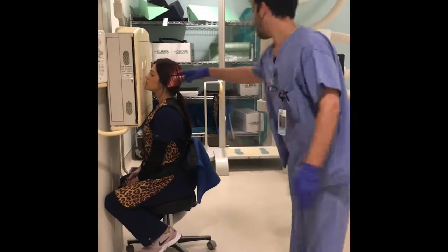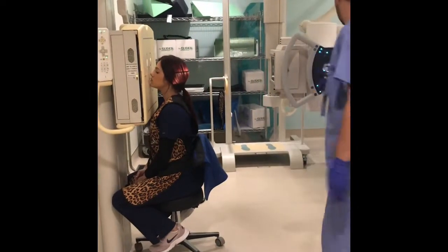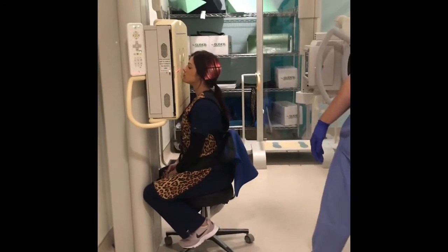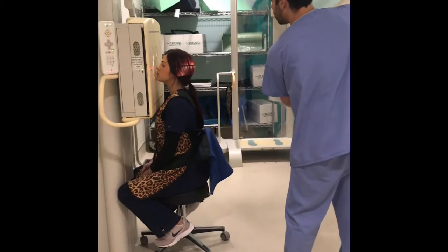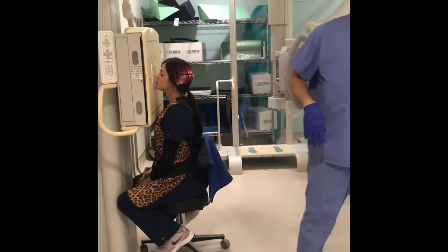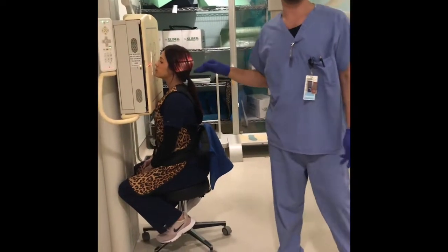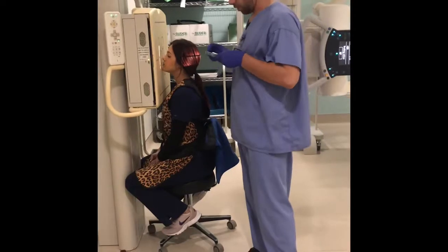So now we have the IOML perpendicular to the CR. And so there's our laser again. Looks pretty good. Just collimate in because we don't need that much skull. So this horizontal CR is going to exit at the nasion. And yeah, all looks good so far.